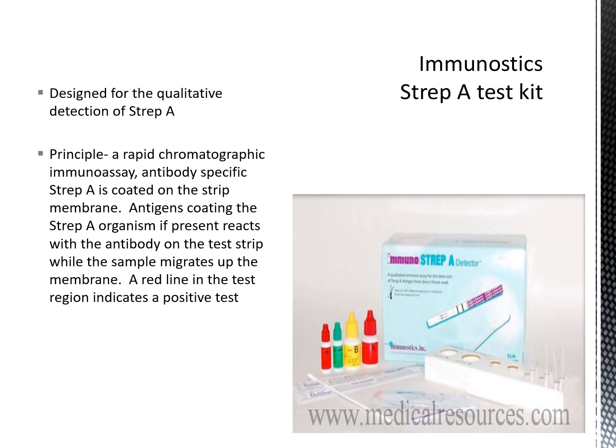If you have one line that is colored, it means it's a negative test. If you have two lines that are colored, it means that it's a positive test. And if you have no colored lines on the test stick, that means the test is invalid.